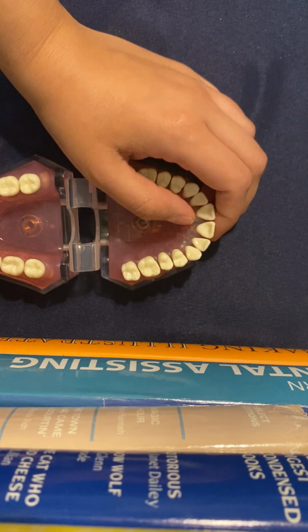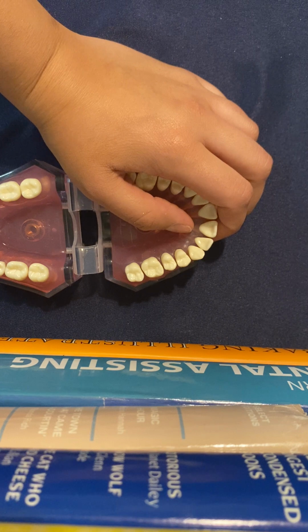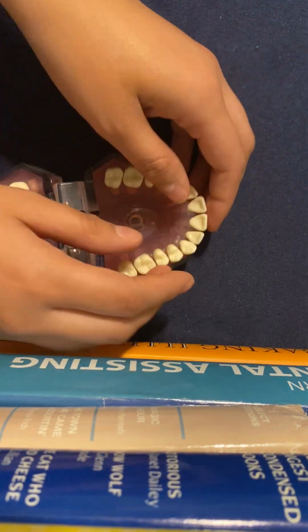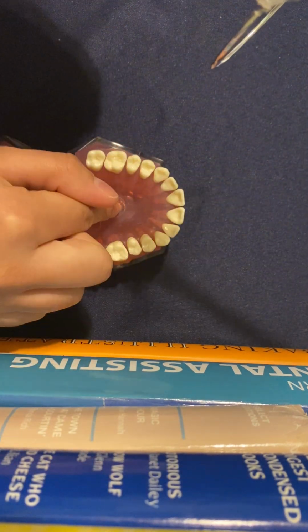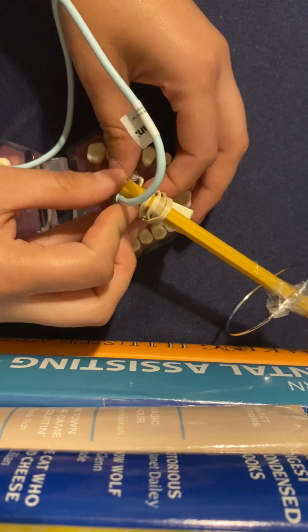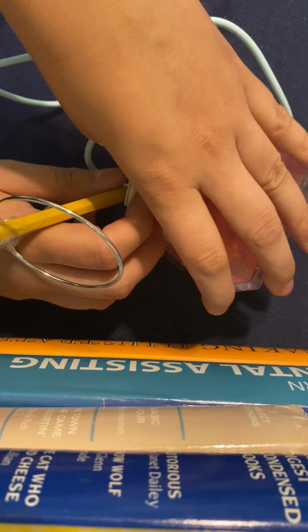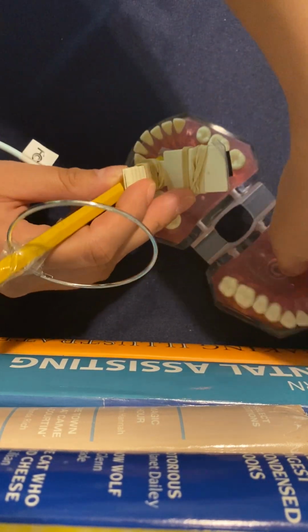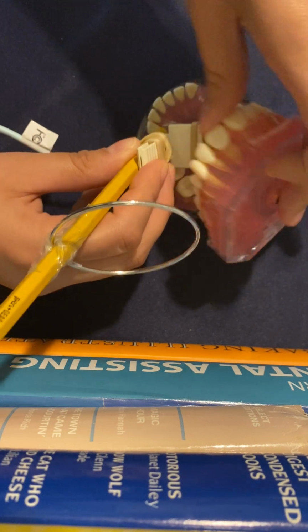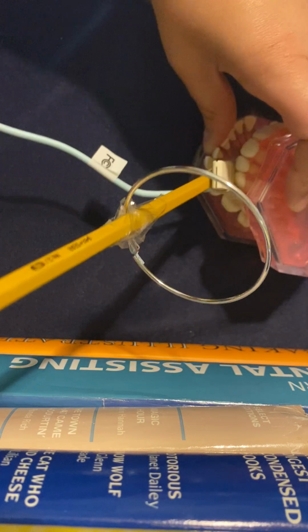Number 3, you're going to want to do the maxillary left canine lateral incisor. So getting that other canine, use your anterior bite tab. You're going to want to get midline, that sweet spot right there, and keep it parallel if you can. And the teeth you're going to want to see with this are the mesial and the apex of the canine, mesial, distal, and apex of the lateral incisor. And I want to get that in the corner of his mouth, if at all possible. So he's biting down on that, keeping that up there.